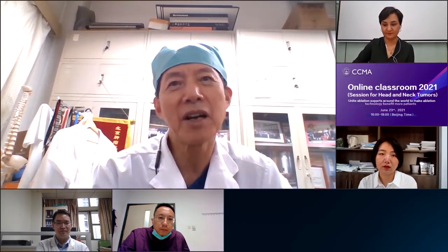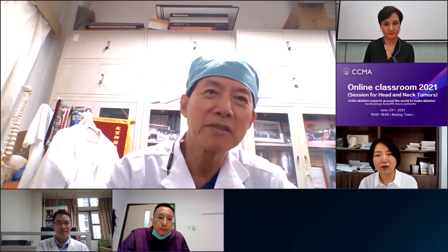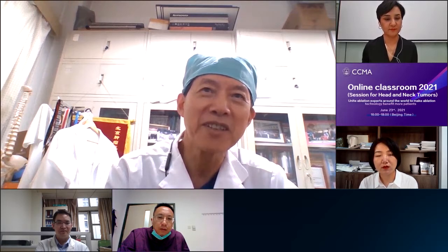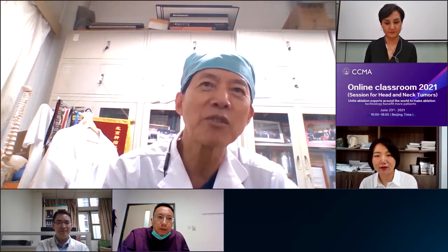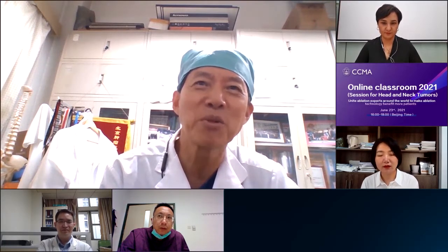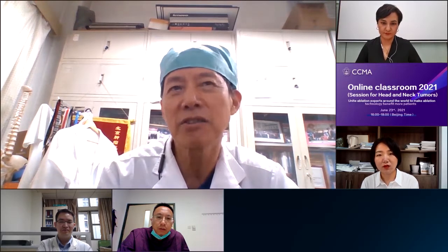So usually we think ultrasound examination for the thyroid tumor, thyroid nodules, is enough. Because compared with the CT scan, the ultrasound examination can give us more information, more detailed anatomy, than the CT scan for the thyroid nodules. Is it right? Yes. So maybe in some special cases, or if the patient wants to do the CT scan, then we can do that. Otherwise, I think ultrasound is enough.